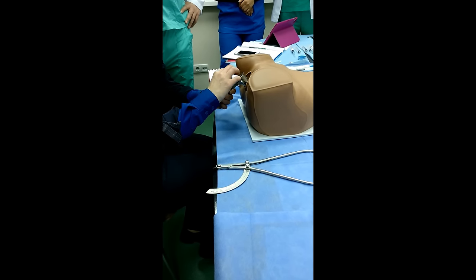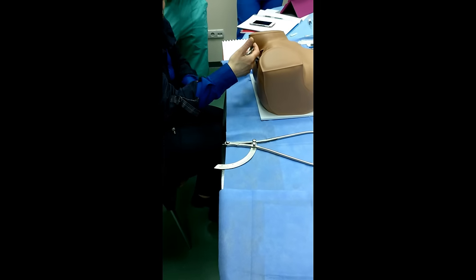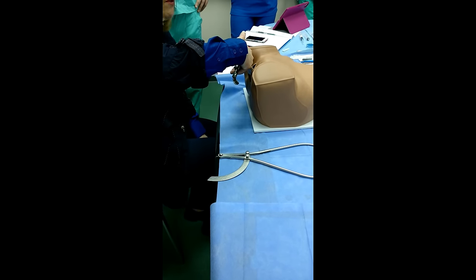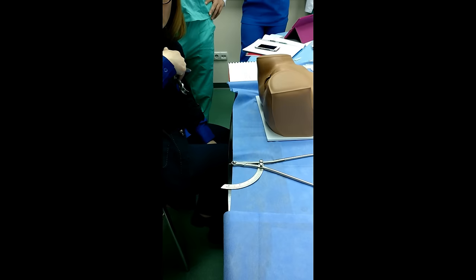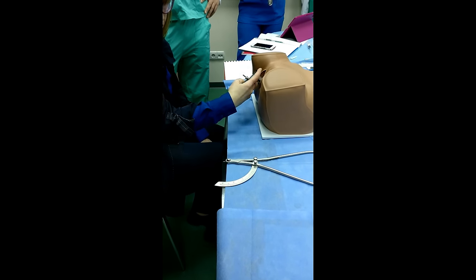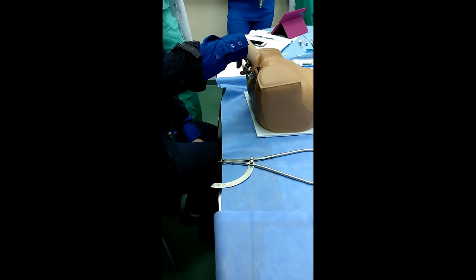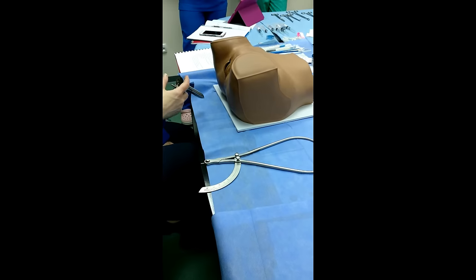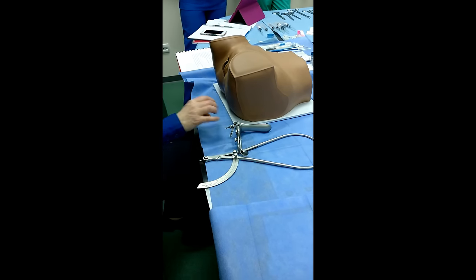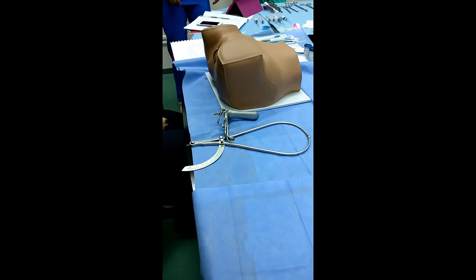After that, we remove the speculum. We close it, and we remove it, rotating 90 degrees. During removal of the speculum, we close it progressively, but we look at the walls of the vagina, the mucosa of the vagina. And during the procedure, you explain what you find.